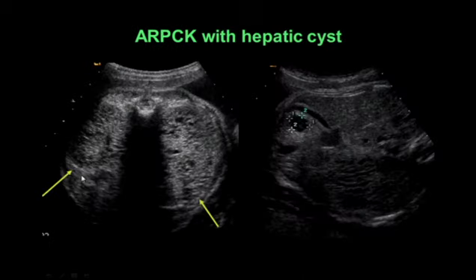This is another fetus with autosomal recessive polycystic kidney disease. Both kidneys are enlarged. In this case, we can see multiple cysts inside the kidneys, whereas in the prior case, the cysts were too small to be seen with ultrasound. In addition to the renal cysts in this case, this fetus also already had a hepatic cyst.